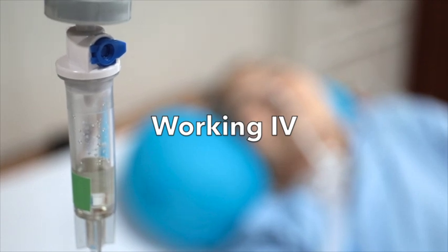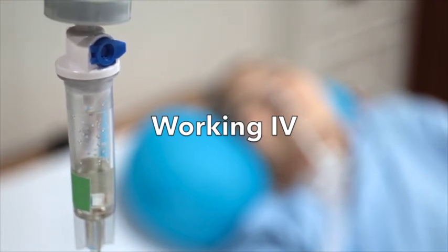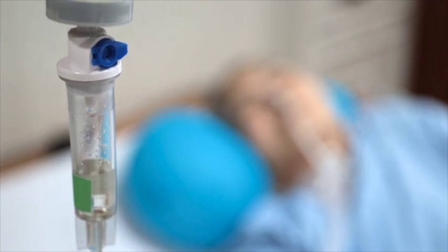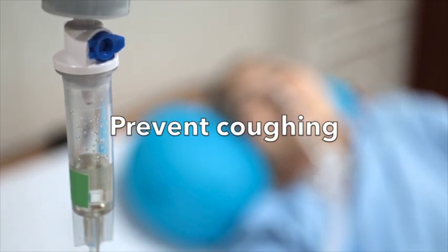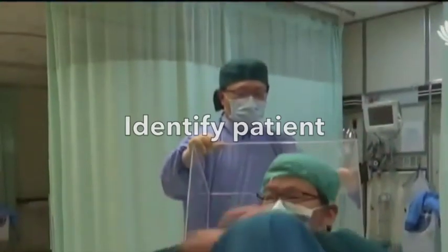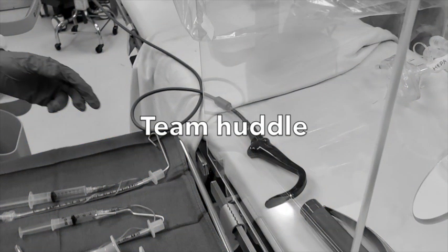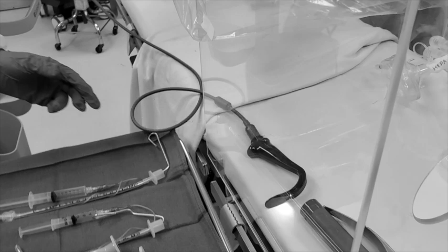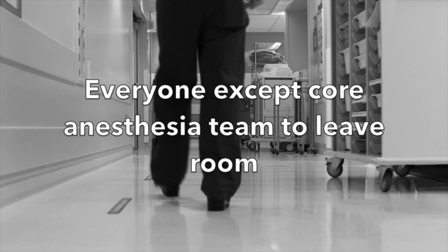Before coming into the room, make sure that the patient has a working IV line. Assuming the patient is stable, provide adequate sedation before bringing the patient to the operating room — this will help calm the patient down and cause less coughing and contamination. Once on the operating room table, the patient should be identified as usual. Before induction, the operating room team will discuss the conduct of the case. Next, all individuals except for the core airway team should leave the room.